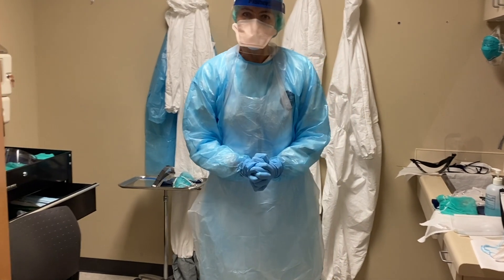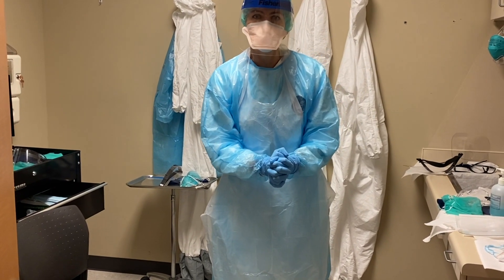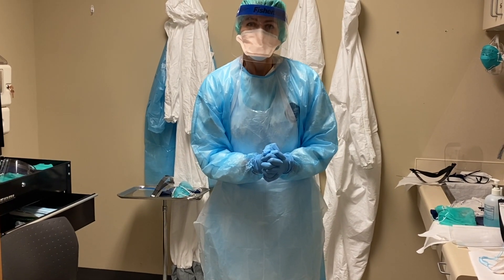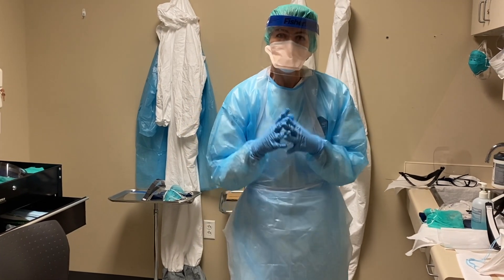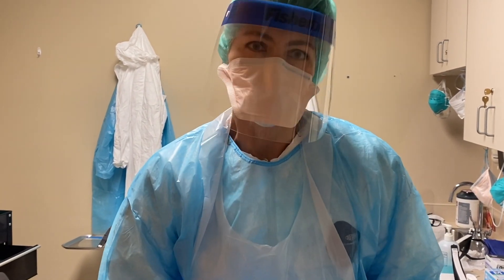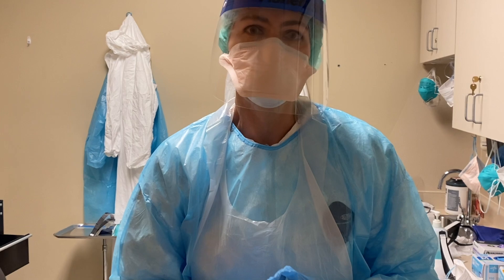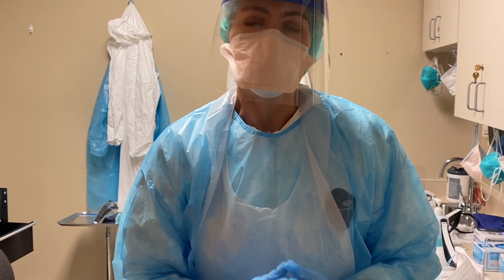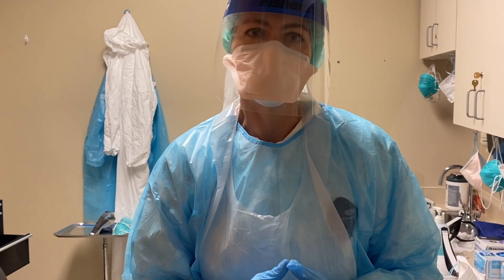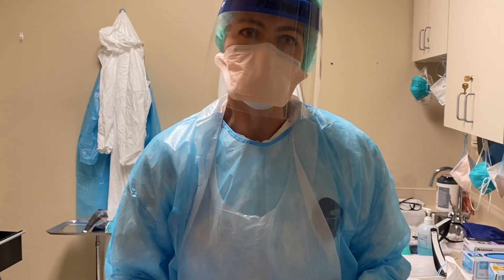Potential places for me to be exposed, of course, are my eyes. My administration has offered me goggles and I just can't tolerate them — I get too foggy. You can maybe see that my face shield is fogging a little bit. Wearing all this PPE is just really uncomfortable and hot. For my colleagues that wear this in and out all day long in the ICU, I applaud you. I'm able to take this off after each patient and I'm so thankful to be able to do that. Okay, I'm about to go see the patient. I'll see you guys again after and show you how to take everything off.